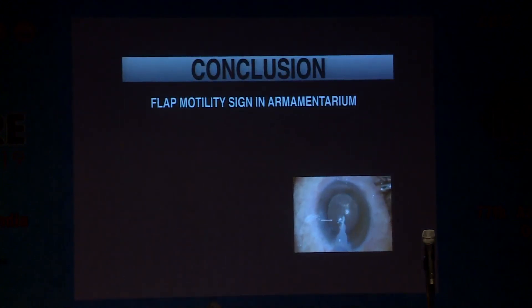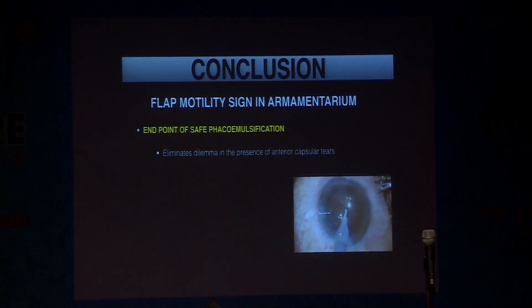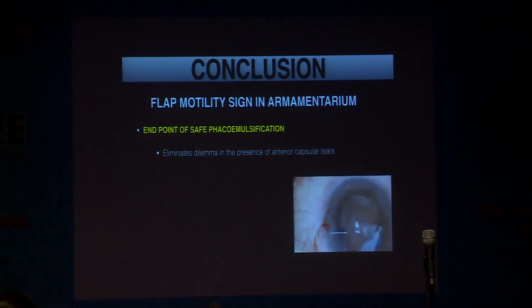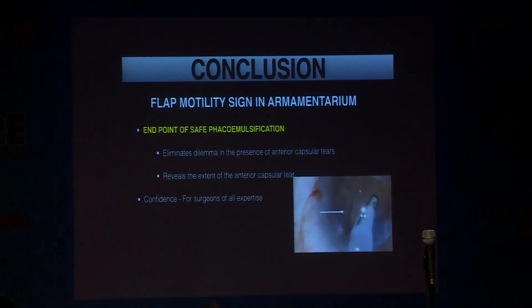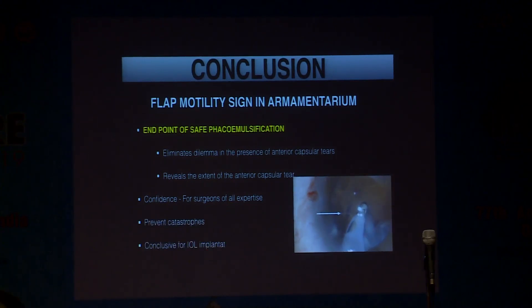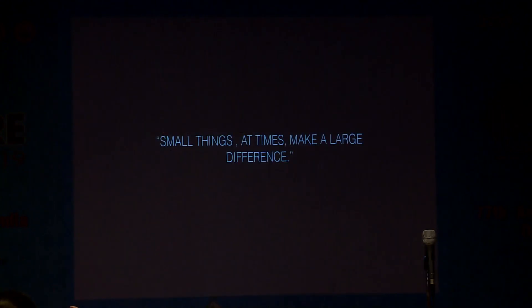With flap motility sign in your armamentarium, it tells you the end point of safe phacoemulsification. It eliminates the dilemma in the presence of anterior capsular tear. It reveals the extent of the anterior capsular tear. It brings confidence for surgeons of all expertise levels, prevents catastrophes, and is conclusive for IOL implantation in the bag. Small things, at times, make a large difference. Thank you very much.